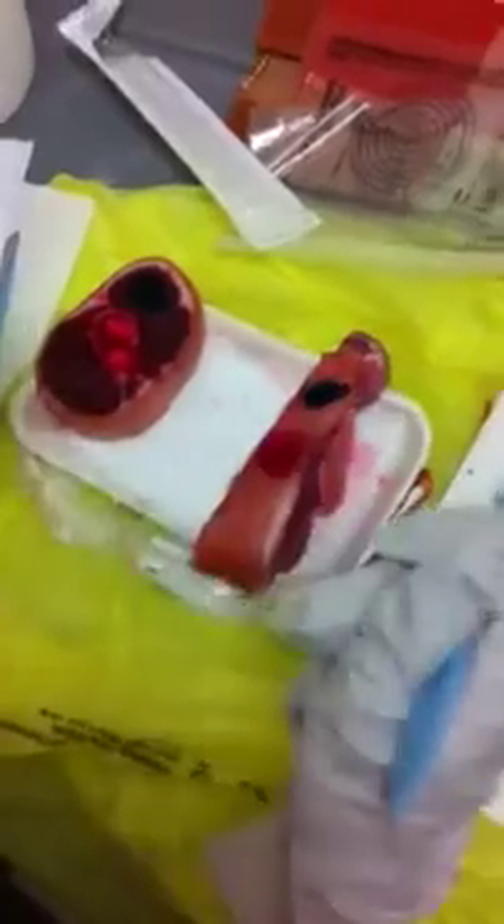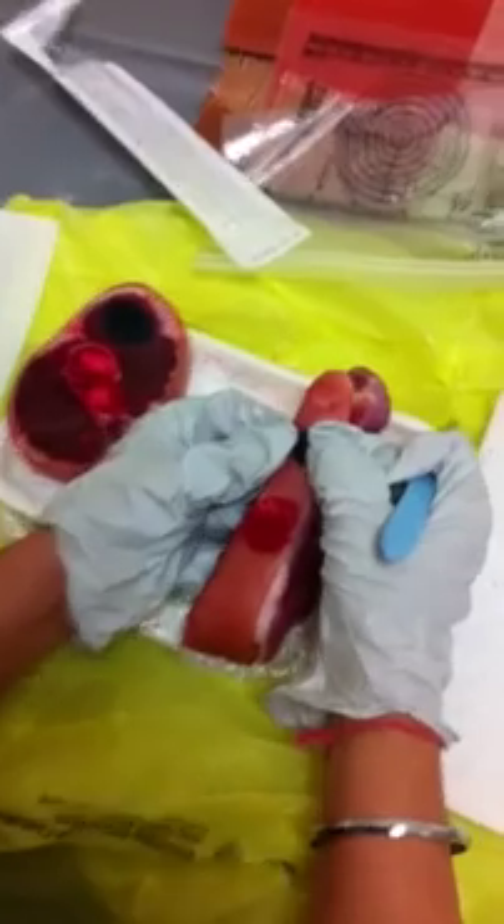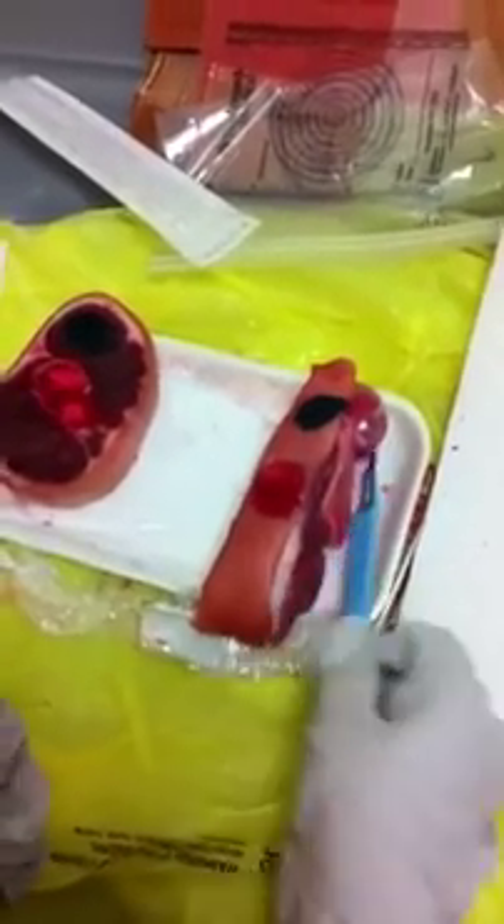I wasn't able to pull it out cleanly — I'm not being dexterous enough with these gloves. Looking at it now, it seems I made it a little too deep because you can see it's white, which means it was deeper and you can see the viable tissue. So that was the cross hatching using scalpel 15.